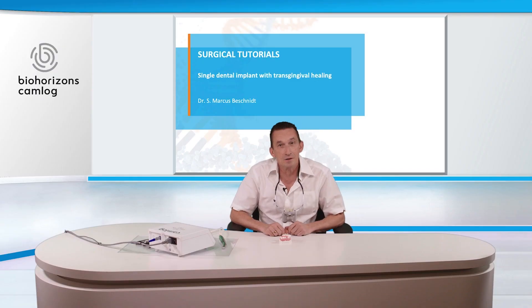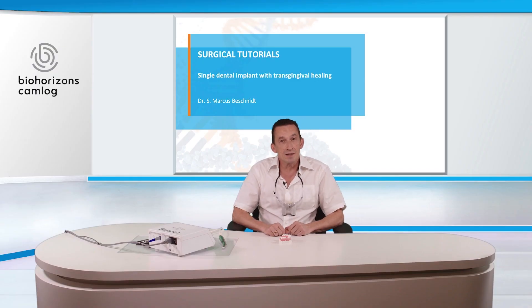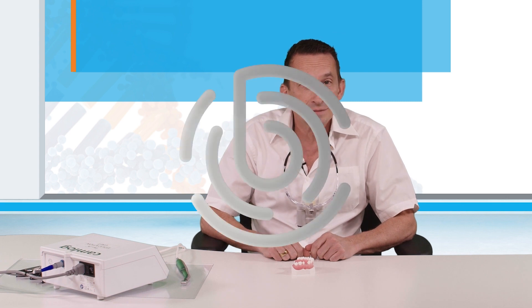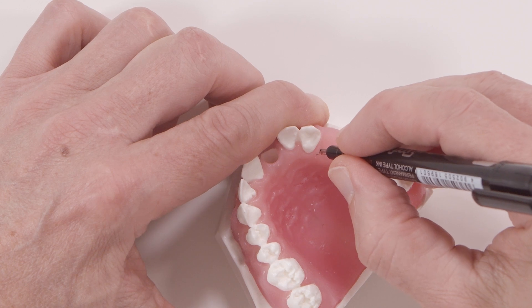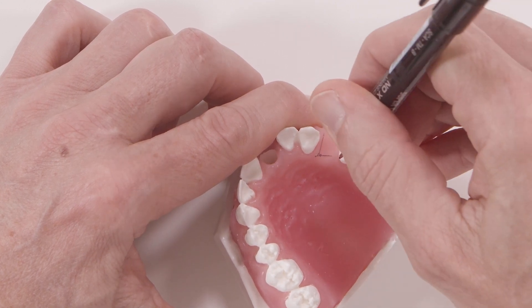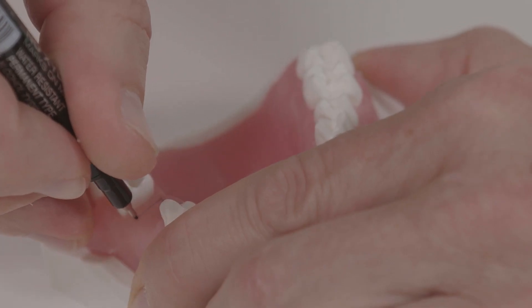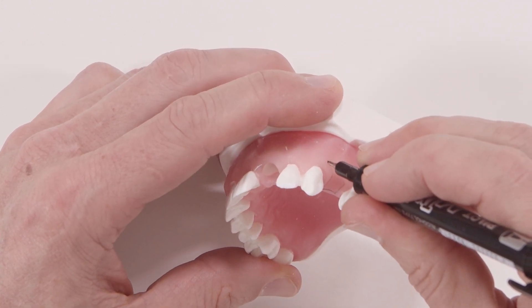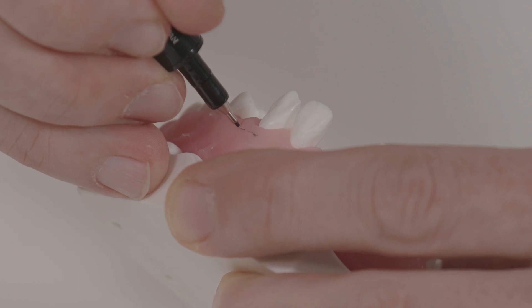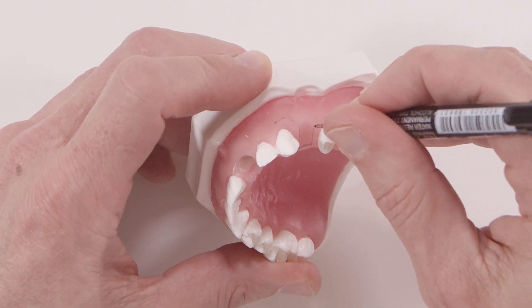In this part I'd like to show you a transgingival implant placement with gain of attached gingiva. Let's start with the incision line. I start with a palatal crestal incision. We leave the papilla — we call it the papilla preservation cut. Then we cut around the mesial and distal tooth, leaving approximately three millimeters of keratinized mucosa.